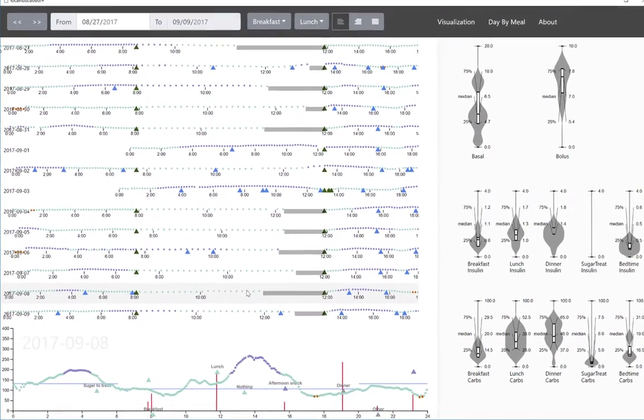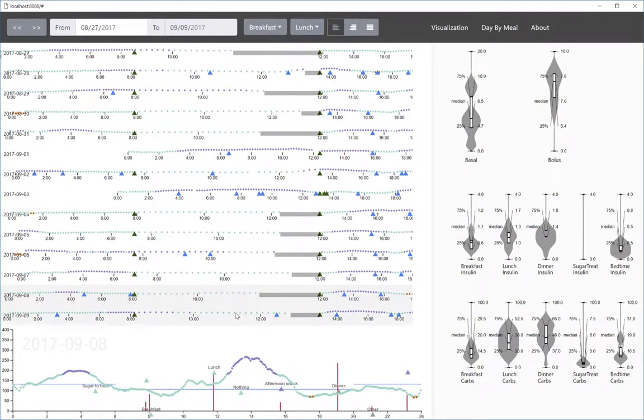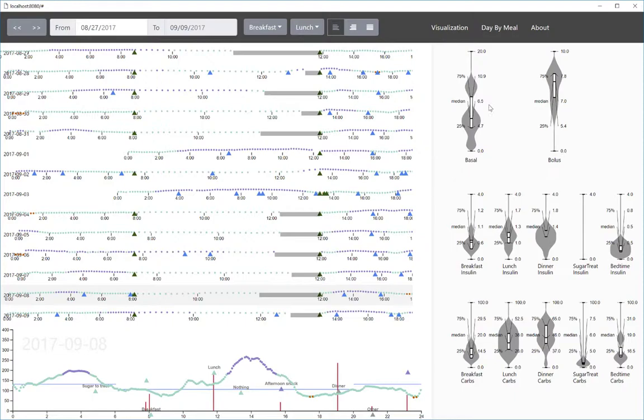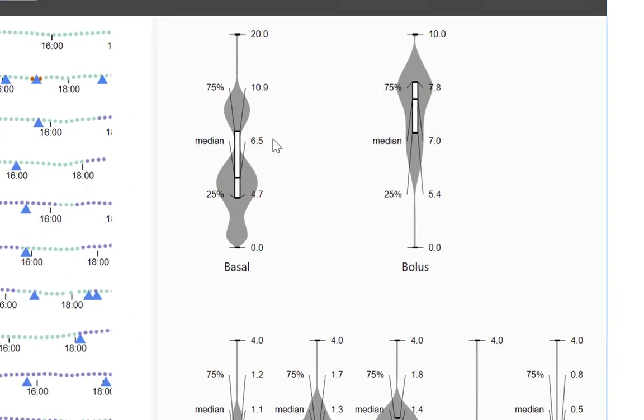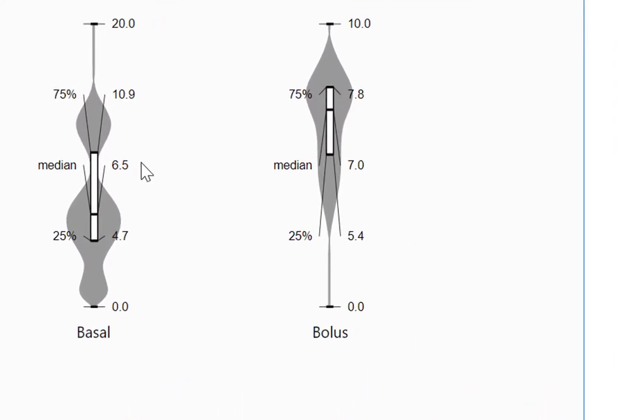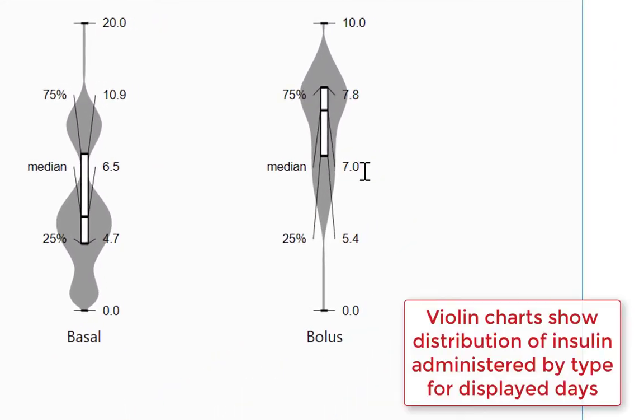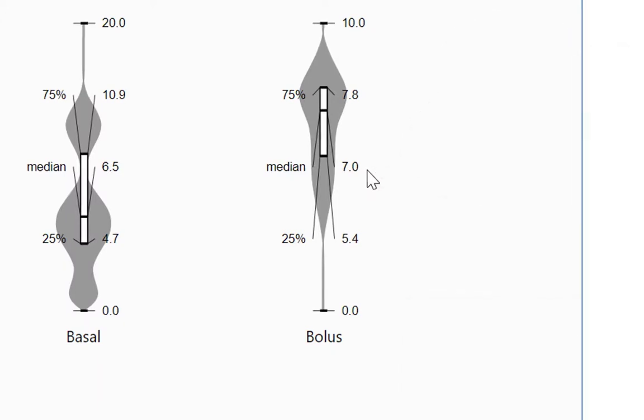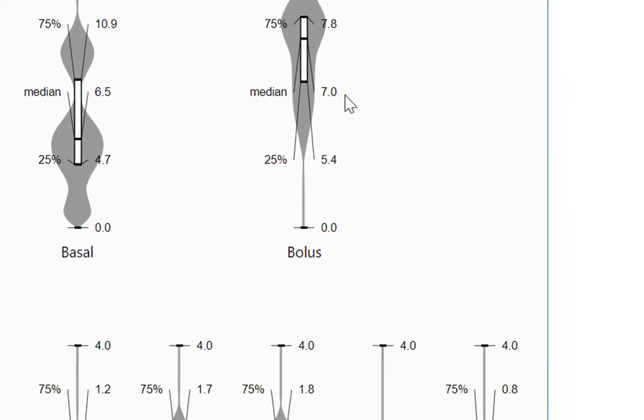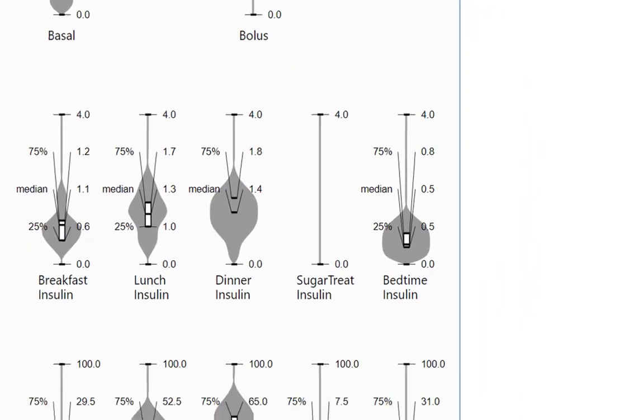How's our insulin protocol working overall? Let's look at our summary statistics view where these violin charts show that we're getting more bolus insulin for meals and corrections than we are getting basal steady-state insulin. Let's adjust our ratios so we get about the same.